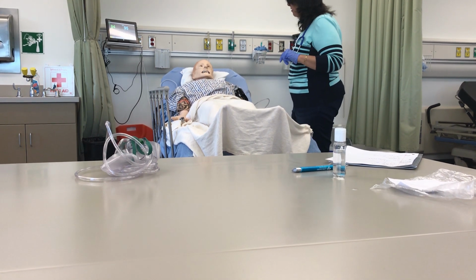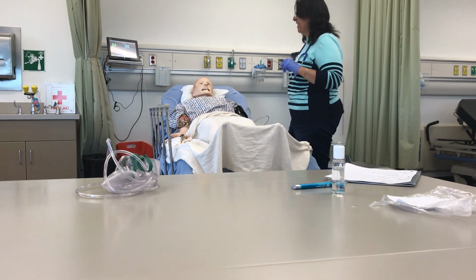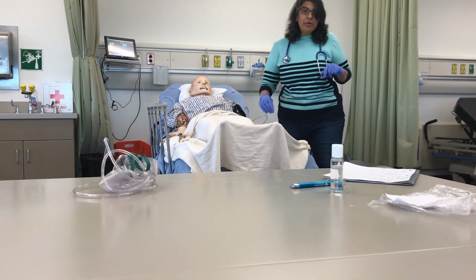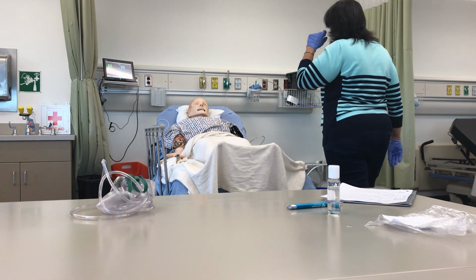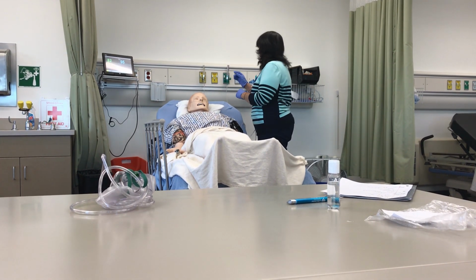Okay. And my doctor's orders were to keep my sats greater than 90%. Well, let's see if I can wean him a little better. Is he in the ED? No, he's on the acute care. Okay.